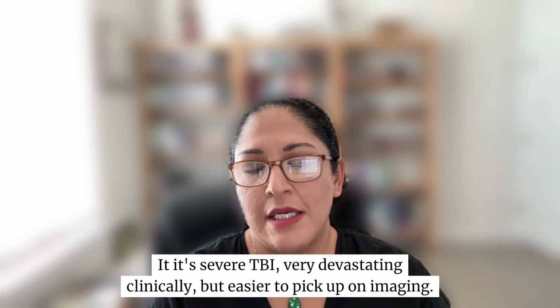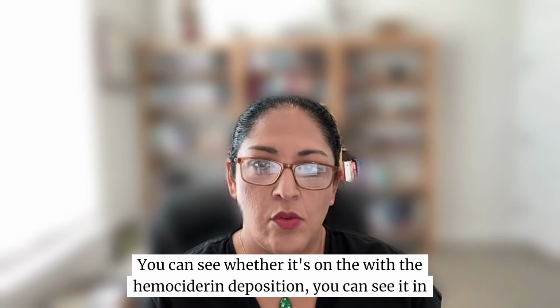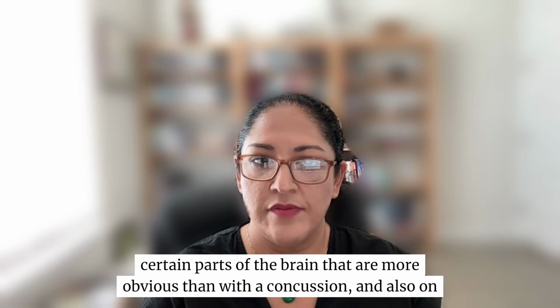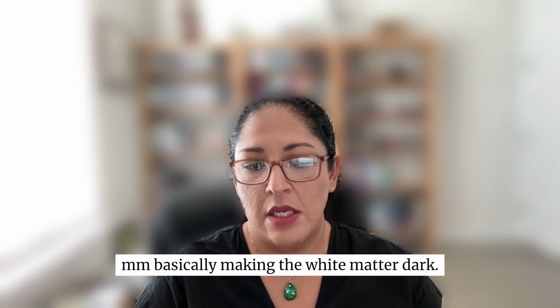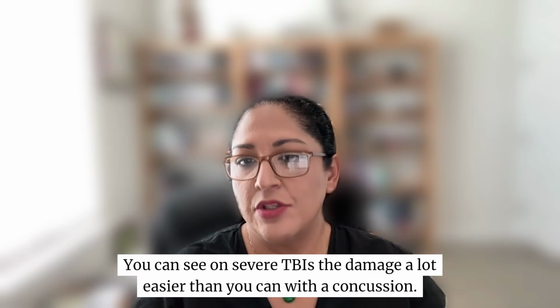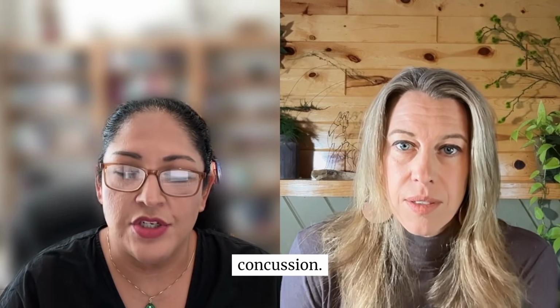Yeah, you're absolutely right. Severe TBI is very devastating clinically, but easier to pick up on imaging. With the hemosiderin deposition, you could see it in certain parts of the brain that are more obvious than with a concussion, and also on FLAIR imaging, which is basically making the white matter dark. You can see the damage on severe TBIs a lot easier than you can with a concussion. You're absolutely right. We're looking for those minuscule microstructure abnormalities with a concussion.